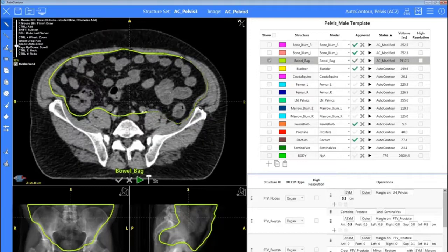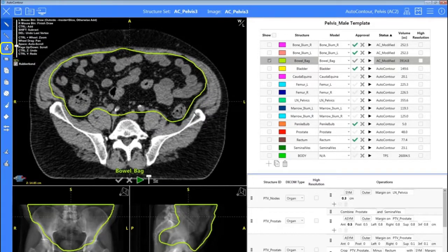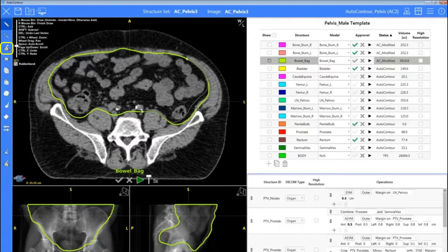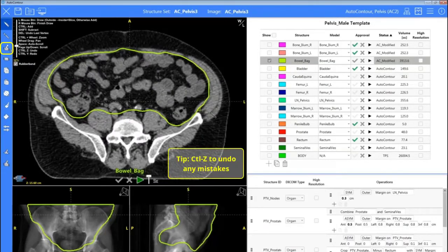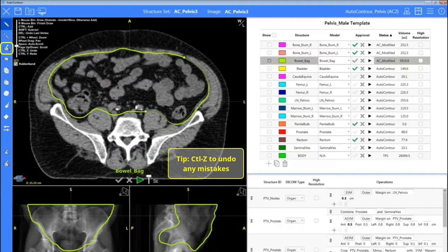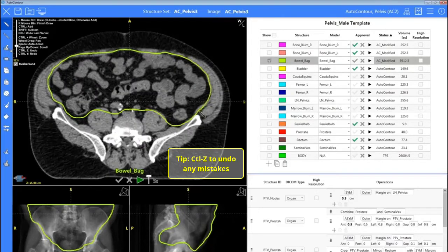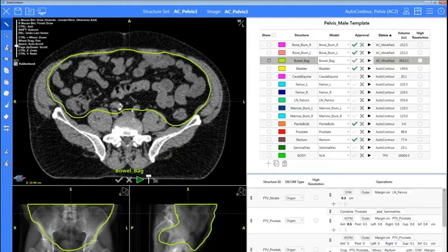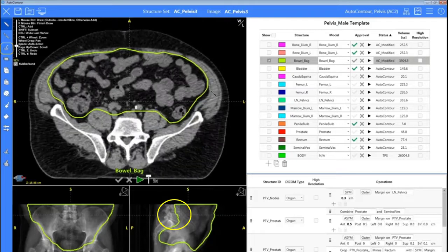I can go every few slices and we can see it's keeping track of those changes for me. We'll go up just a few more slices — we can hit undo in case we make any mistakes — and keep pulling that bowel in. Then we use edit interpolation and we can see where it's pulled that in for us without having to edit every slice.